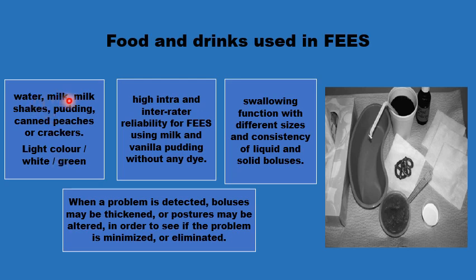Water, milkshakes and puddings, canned peaches, crackers or biscuits can all be used. There is good evidence that milk and milkshakes can be identified easily during the procedure. And if you want to avoid the use of any coloring dye, this can be used.